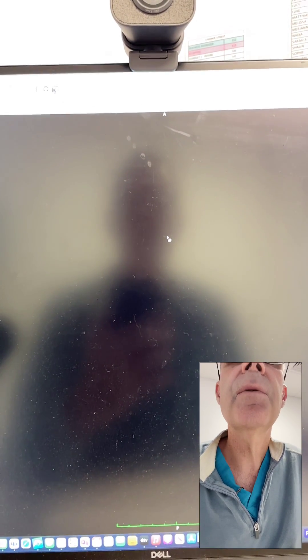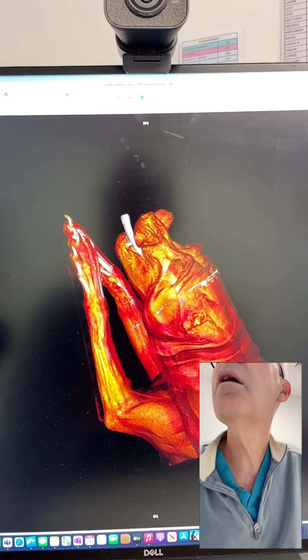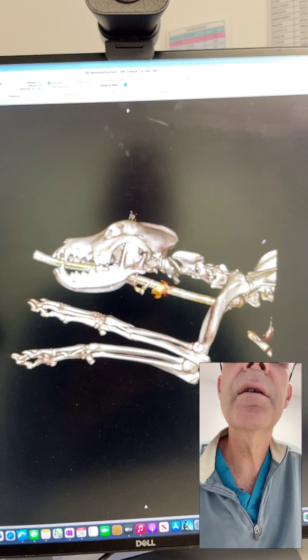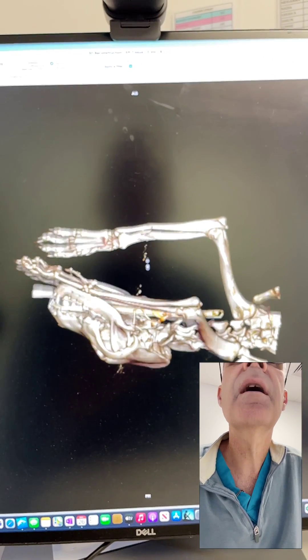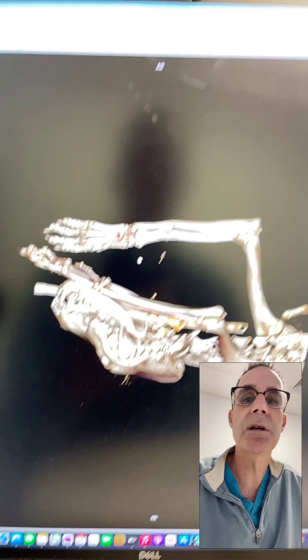If we go back into the CT scan and do our 3D volume rendering, we can look at that fracture again. This was the fracture here — that's what it looked like beforehand. You can see that one little fissure heading down distally.